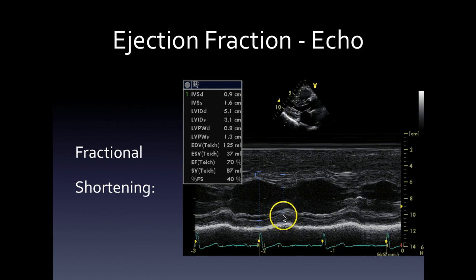Now, it's meant to be somewhere towards the end of the T-wave, but honestly, the best thing to do really is eyeball it and make sure you get the thickest piece. When it's a beautiful, clear tracing like this, it becomes relatively easy. However, I will challenge you. Where did I put the cursor in the right spot here? Would you put it here? Okay. So again, it's down to experience.